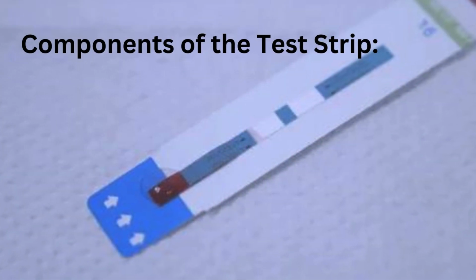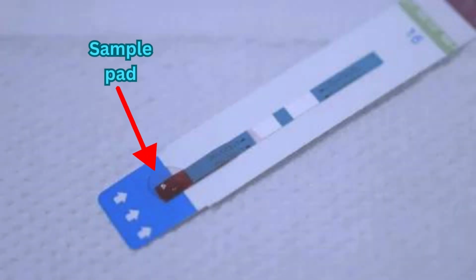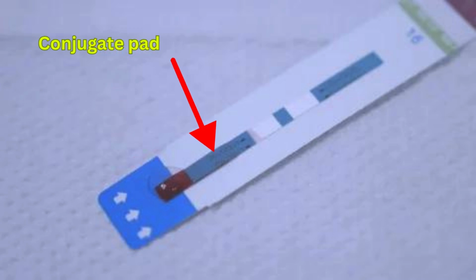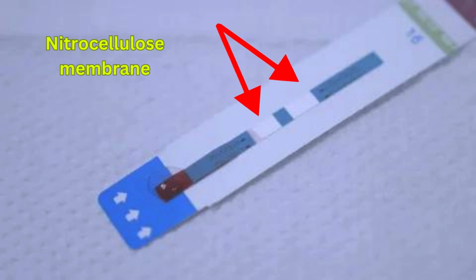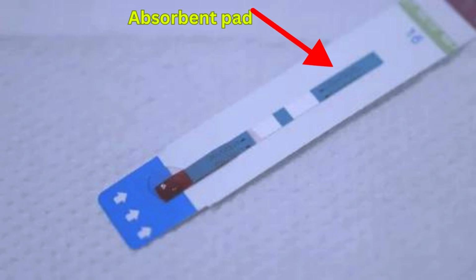Components of the test strip. 1. Sample pad. This is where the specimen, blood, saliva, or urine, is applied. 2. Conjugate pad. This contains HIV antigens, proteins from the virus, labeled with a colored particle, usually colloidal gold. 3. Nitrocellulose membrane. This is the main reaction zone with test and control lines. 4. Absorbent pad. This draws the sample through the strip.